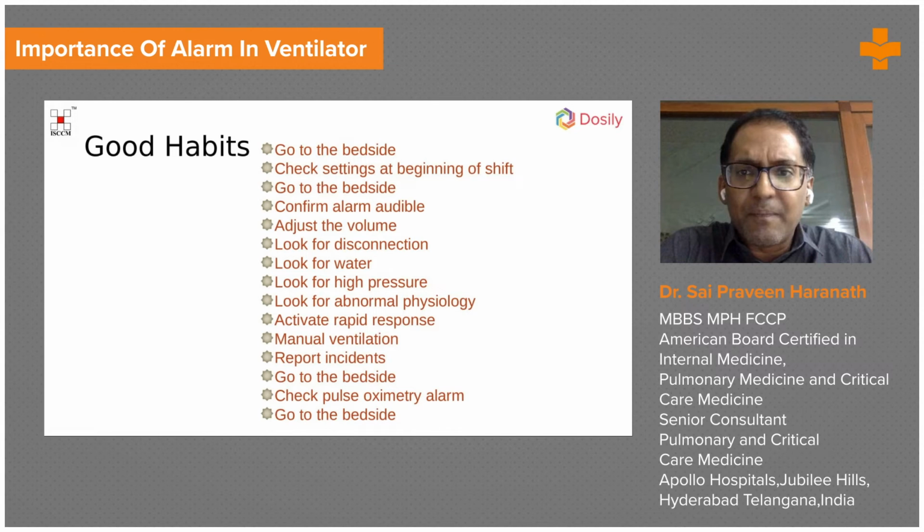There are some good habits. This is probably the most important. Go to the bedside, of course, wear your protective equipment.